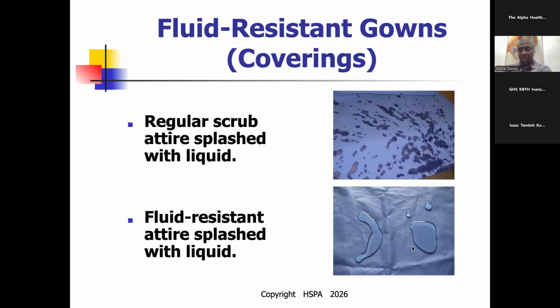The infection from the instrument is not going to your staff. Very important here, you are not spreading it.